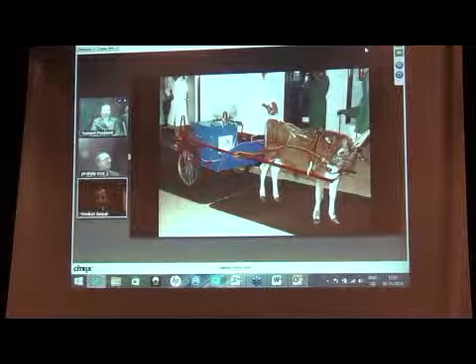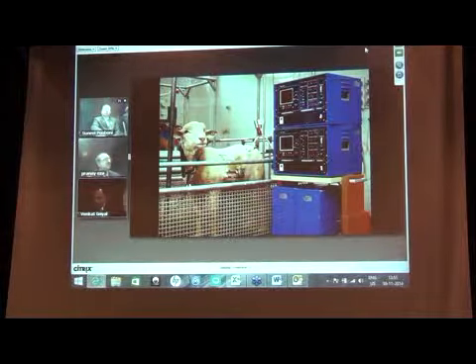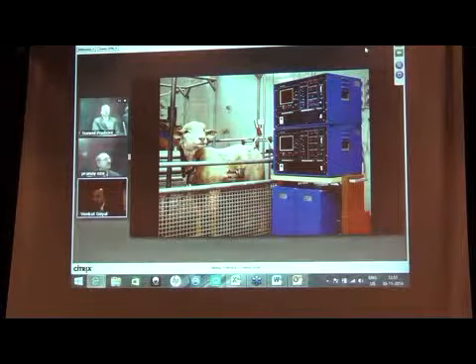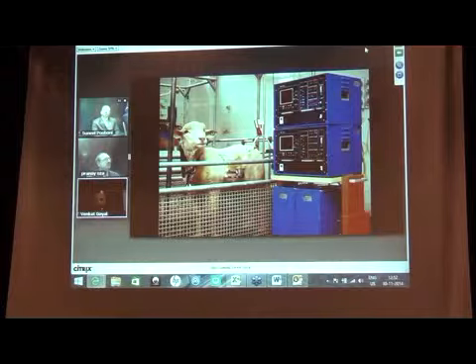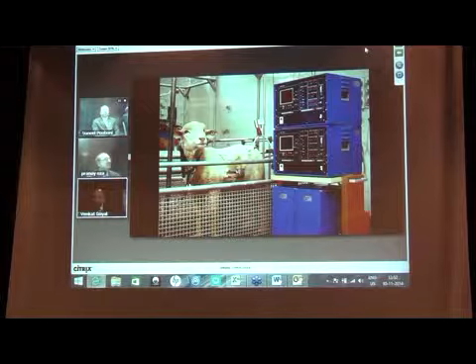This is again trying to show you the console, which was previously pneumatically driven, and that round thing here was a sort of suction pump, a suction chamber. The diaphragm would move this side and the blood would come in, and the diaphragm would push and the blood would get pushed by this suction device. This big console was required to maintain the circulation in animal experimentation.